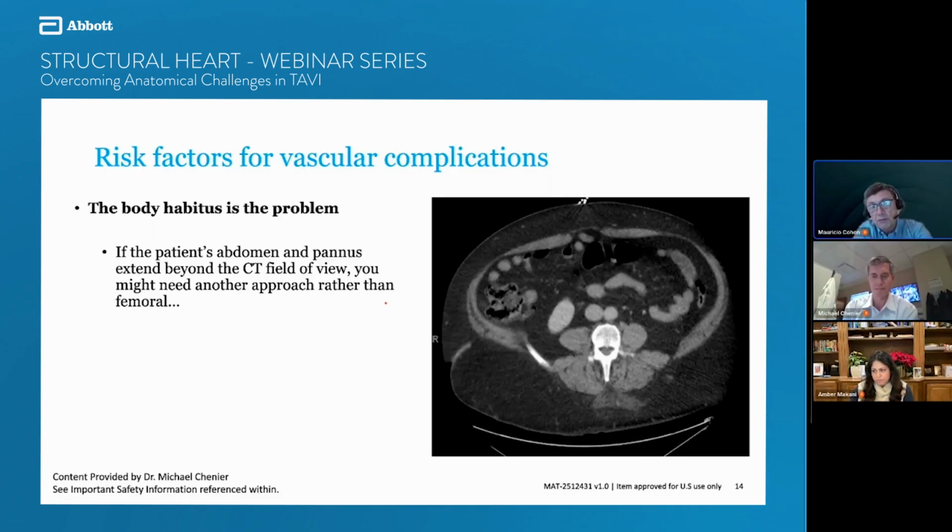Then using IVL, that's our calcium modification strategy of choice in our program. It's important. Sometimes you may think, this platform has an inline sheath. So for example, for those bends that you see in the aorta, you may want to think about putting in an 18 French sheath or a 15 French sheath or a 20 French sheath, whatever the specification is, because that's going to traumatize the vessel less, and that may give you a little better support to overcome the tortuosity.